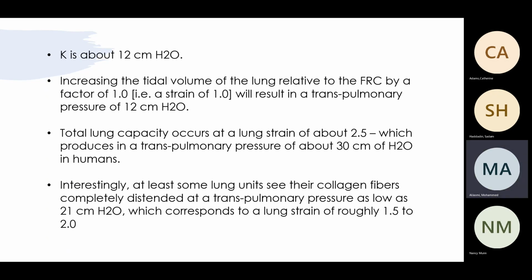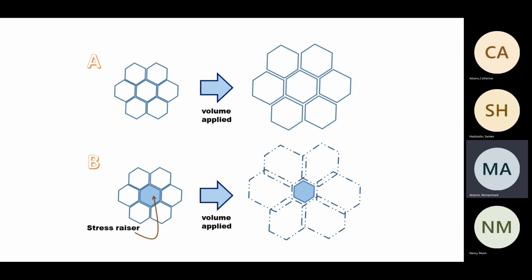Got it? Any questions? Even if you know this, you cannot give equal distribution to the lung. You will be a little bit not equal. Why is that? Because if it's a normal lung with a normal airway, if I give a volume of 500, that 500 might go in equal distribution, is that right? But I have some alveoli not working well, some airways not working well. We know that we are not giving everything equally to the lung, is that right? Maybe it is, maybe it's not, but most probably it's not.